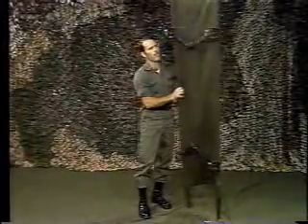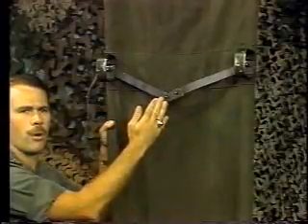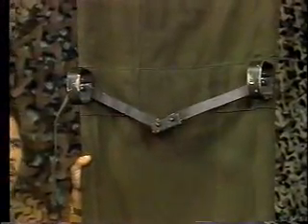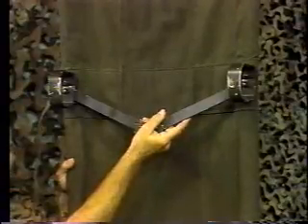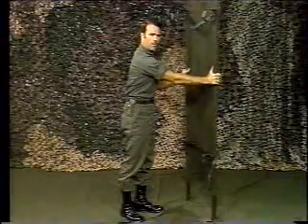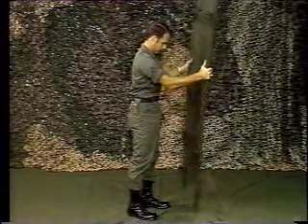Now, you notice that between the litter rails we have two metal devices known as the spreader bars. The spreader bars are put there to lock the litter open and keep the canvas tight. Because of the design of the spreader bars, it's very easy to pinch your hand or possibly cut yourself if you open them with your hands. So we recommend that rather you open up the side rails, face the bottom of the litter, and kick the spreader bars open and into place.